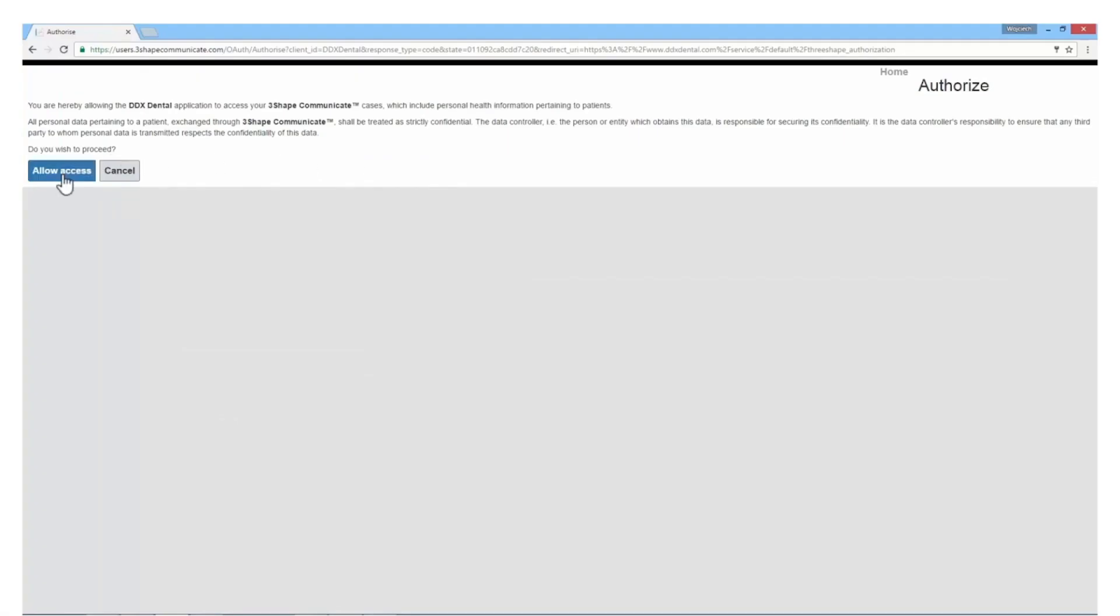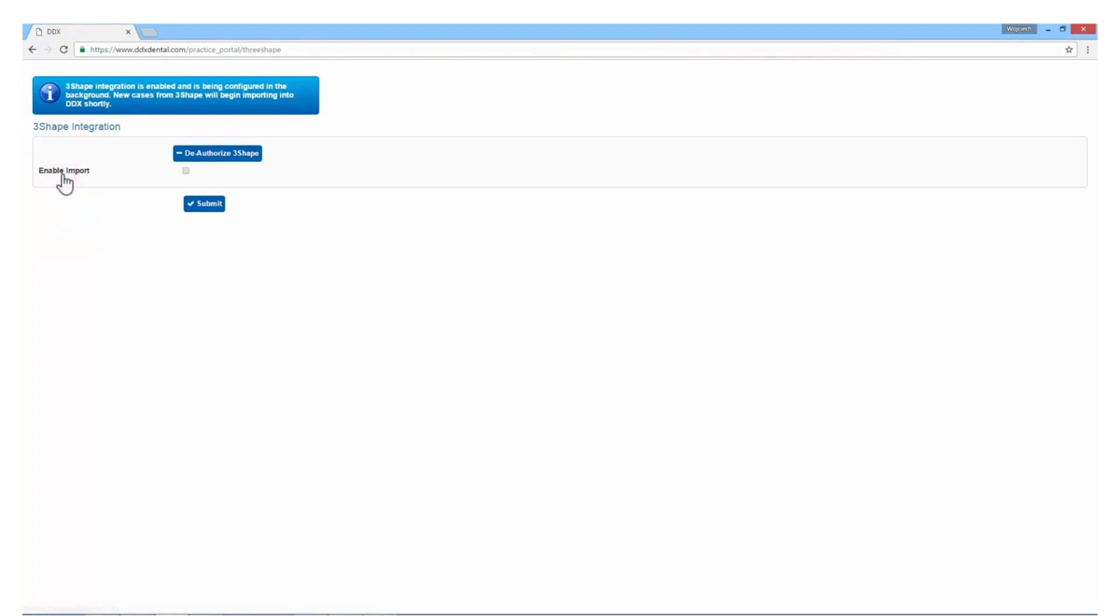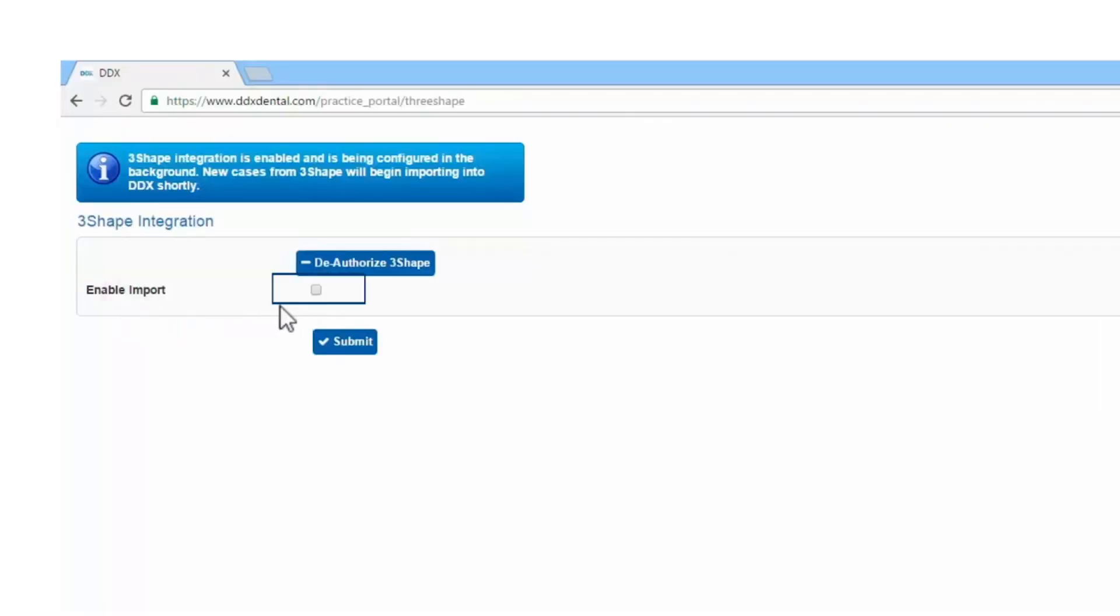A notification will now pop up. Click Allow Access. Check the box for Enable Import. Click Submit.